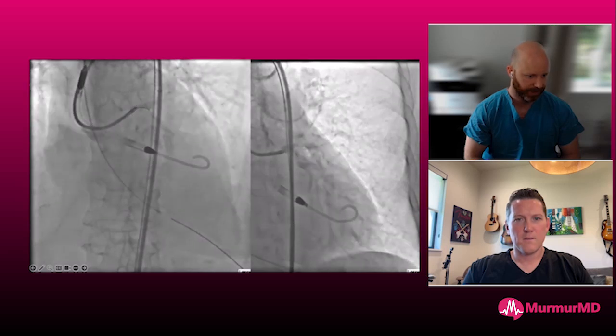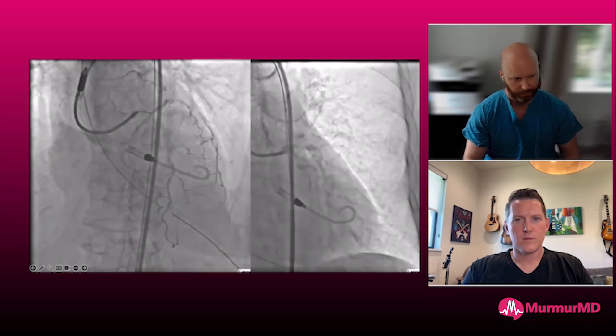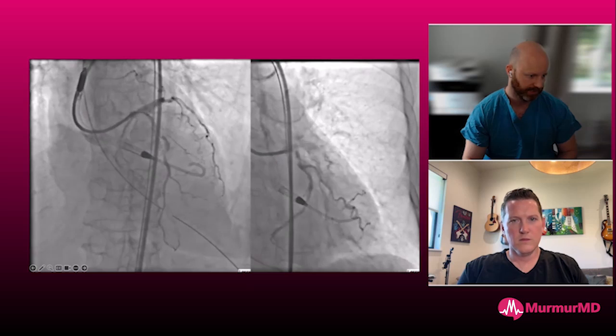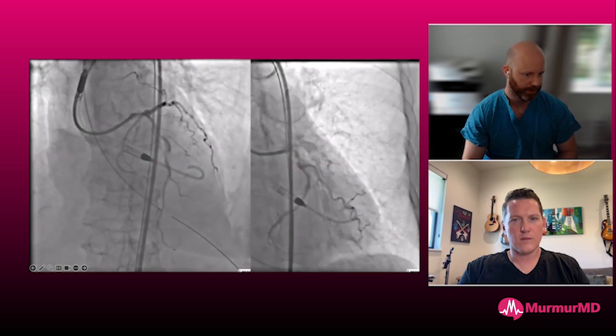These are obviously somewhat better angiograms just because we have a guide catheter, so we're able to deliver a lot more contrast. We do a lot of our work in 7 French guides, whether femoral or radial. In this case, this is a companion sheath case, which we're really happy with. We think that's one of the best things that's come out in quite some time. It's quite deliverable. It's hydrophilic. We really like the companion sheath a lot here.